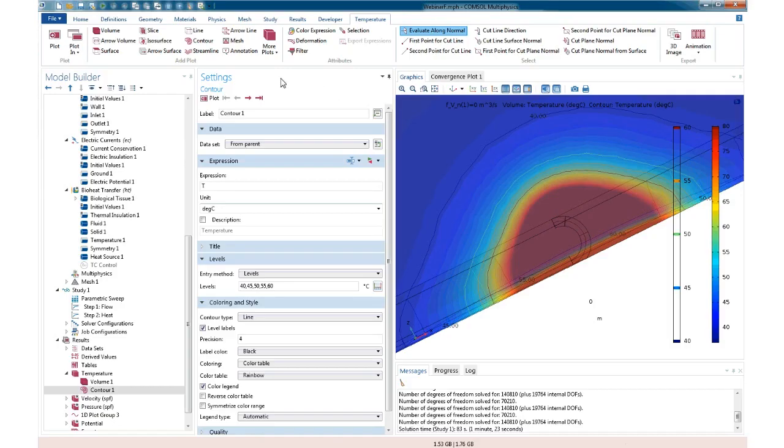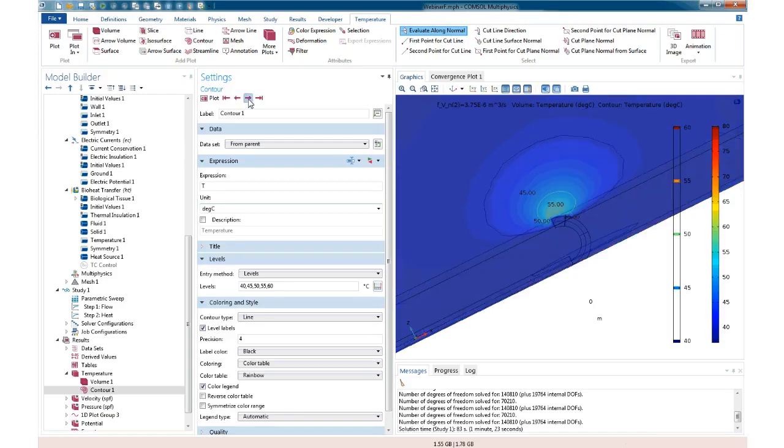A couple of very interesting things. Number one, of course, your symmetry is gone. This is very surprising to some people, but here's the thing that's most surprising to people. The hot spot, you'll notice, doesn't even touch the electrode. That's pretty non-intuitive. People think the electrode is the source of power. It ought to be the hottest.